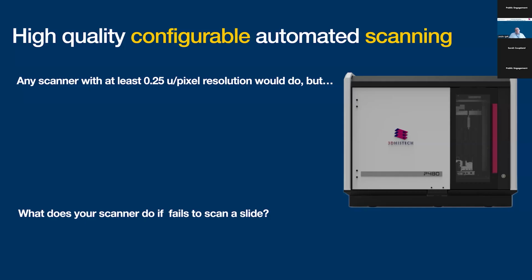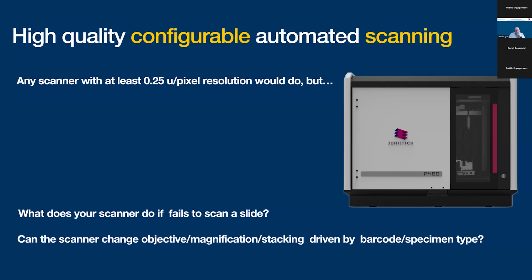I wouldn't advocate overnight scanning, and it is more of a contingency measure. But if you do it, and if your scanner fails through the night, you can't do anything about it unless you have got real-time monitoring of your scanner.